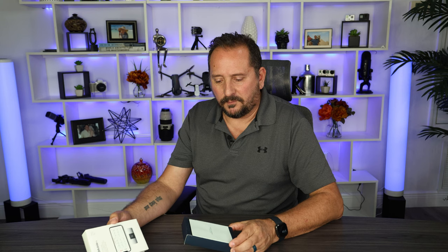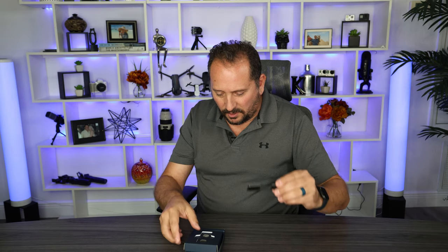All right, let's see what's inside here. It's really nice packaging. I don't know why — I saw all the pictures but it is so much smaller than I thought it was going to be. This is all it is.